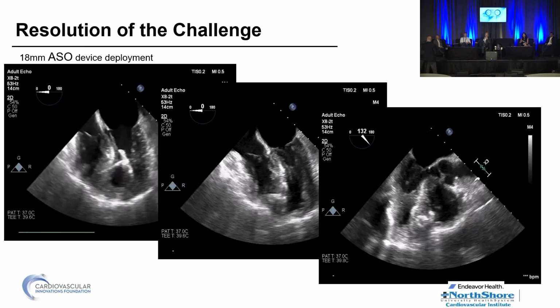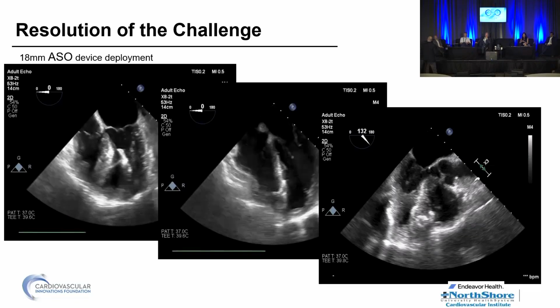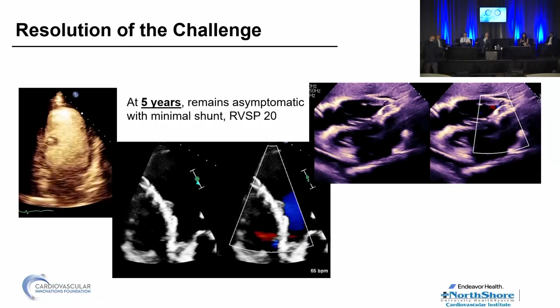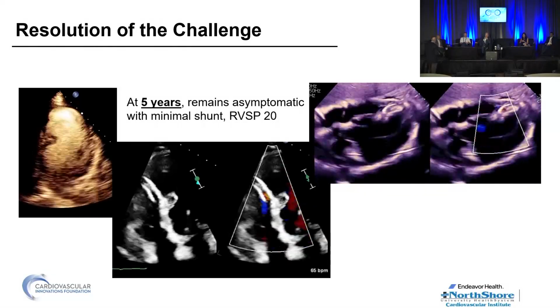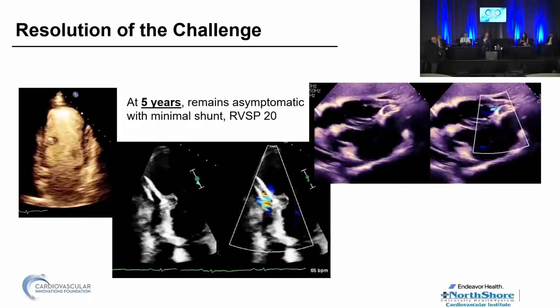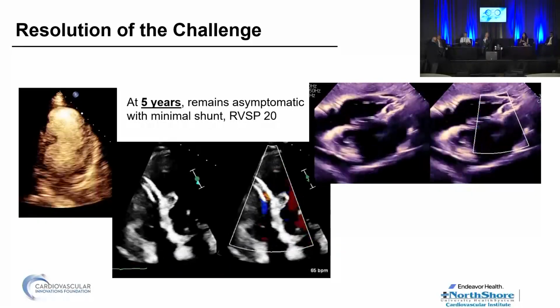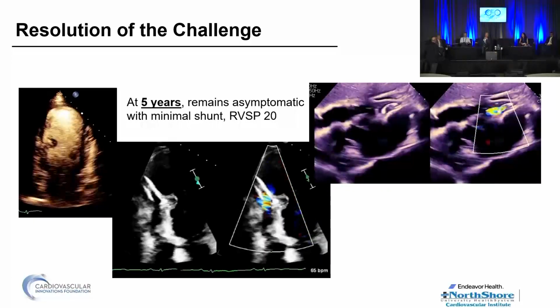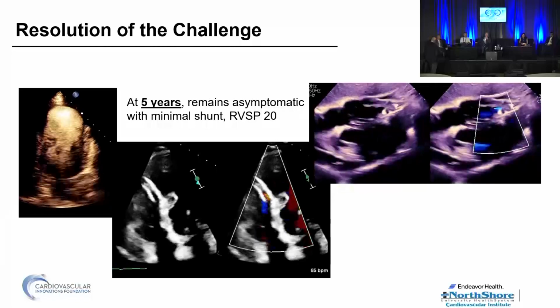The middle frame, maybe that'll play, but we deployed them in on the right. You can see that it's fully deployed across that. Took no time at all to do this. And the main reason I want to show this is that we did this with the hope that maybe she'd come back in 8 weeks and the surgeon would now be the hero instead of me. But she's just done great. I mean, she had an infarct, but she really is, for the most part, completely asymptomatic.